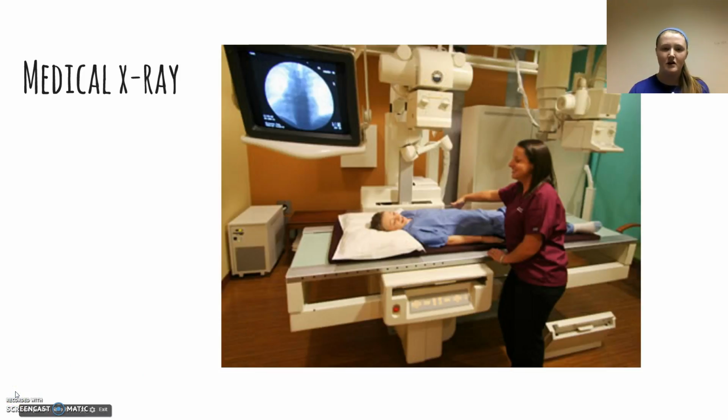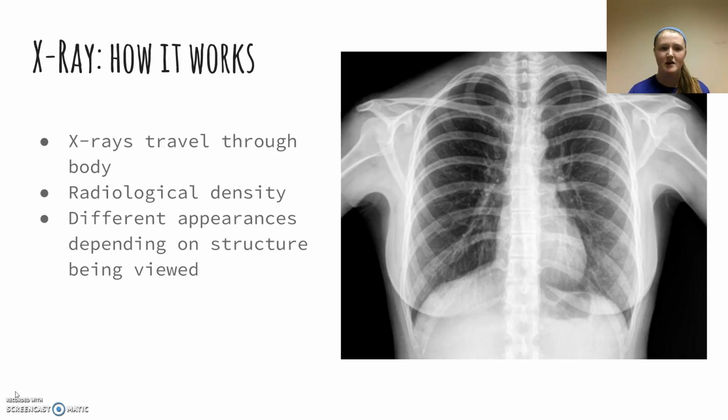Okay, so medical x-rays are a form of electromagnetic radiation. This is just a picture of a patient receiving one. They use x-rays that travel through the body, and the way the picture is formed depends on radiological density. This is determined by both the density and the atomic number of the tissues. Bones more readily absorb the x-rays, and they produce a high contrast on the x-ray detector. The background is always black. Bones usually show up pretty white, and the bony structures appear whiter than other tissues against the black background.